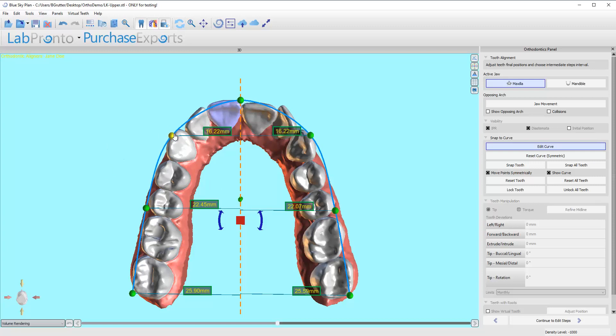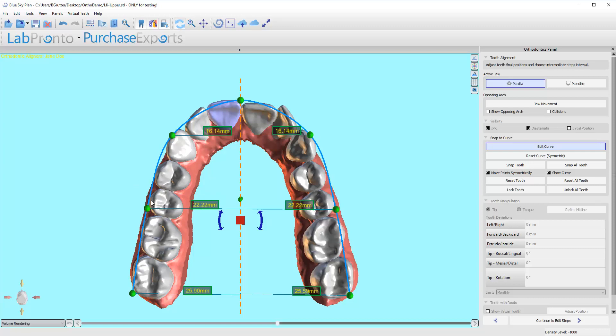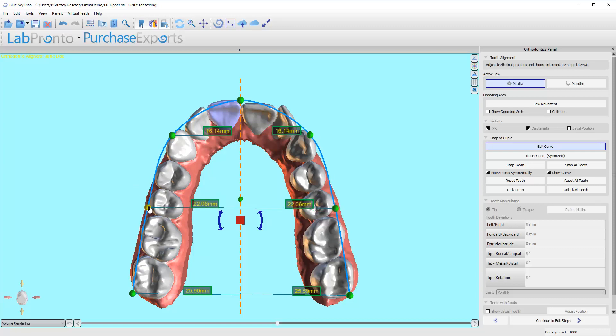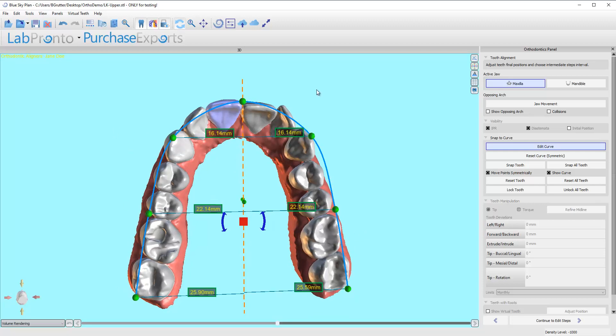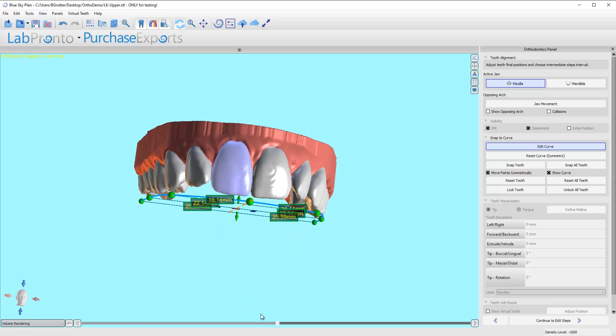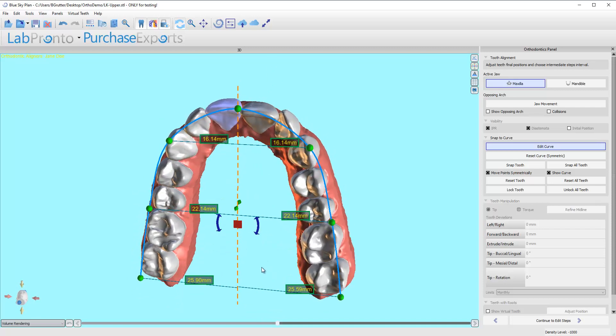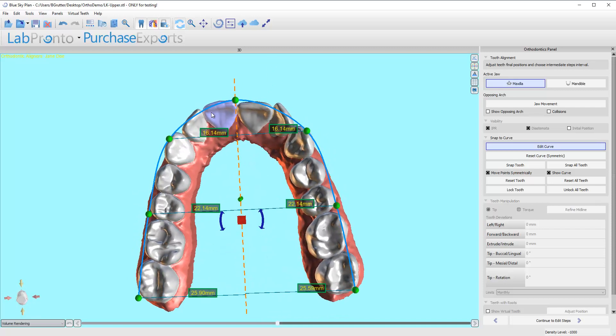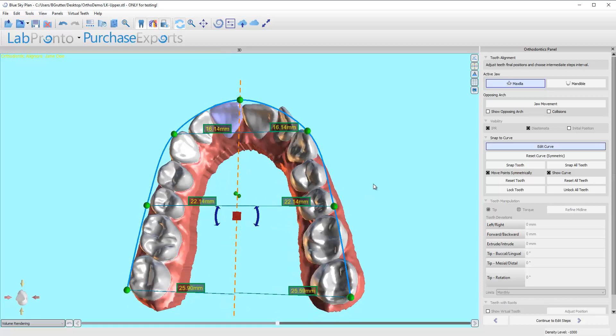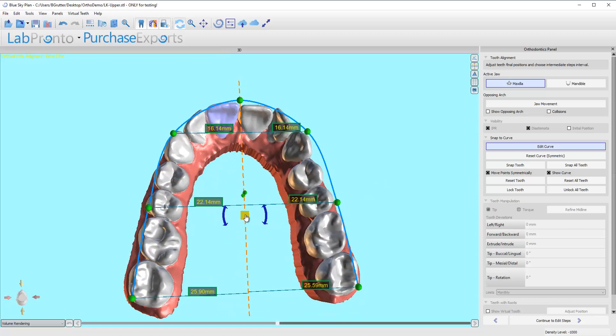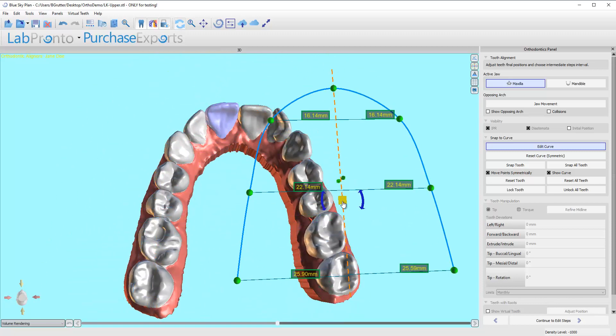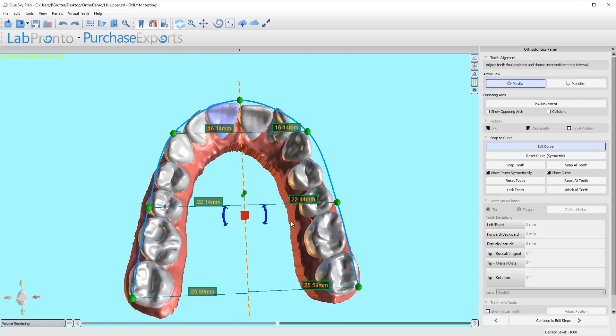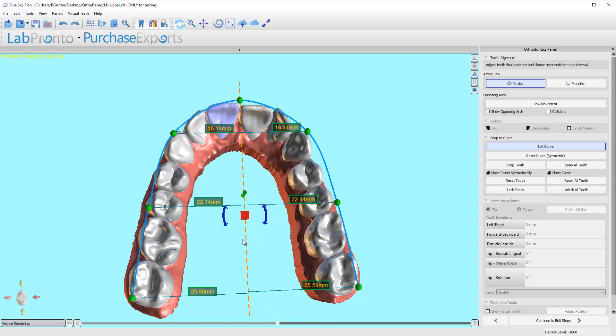In this case, this patient who is actually my hygienist isn't looking for significant changes, but let's go ahead—I honestly haven't even tested her case in this software, which is kind of silly for a workflow video, but why not. Now you can see the actual mistakes I might make. Let's go ahead and widen up her arch a little bit because she's a bit narrow. I can move these nodes however I want. If you need to, you can actually move the whole curve around—Control Z to undo that. I can rotate the curve if I want—Control Z to change that off.